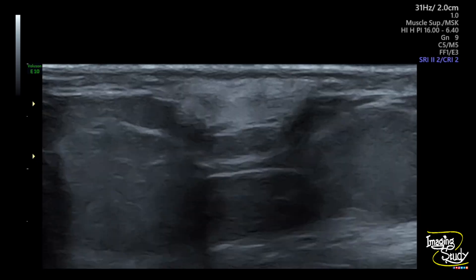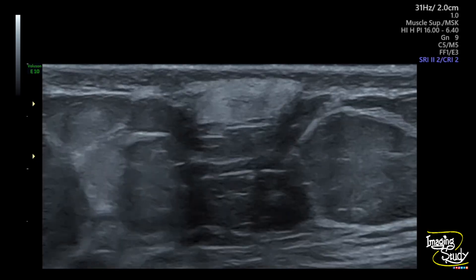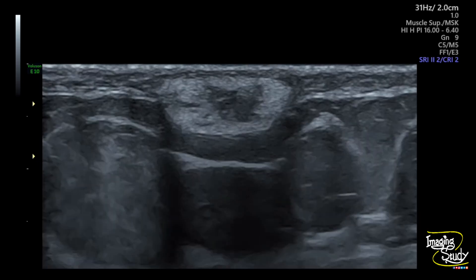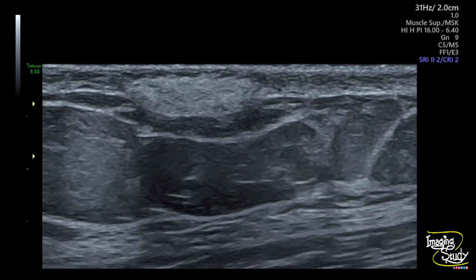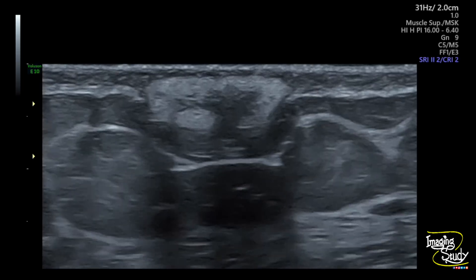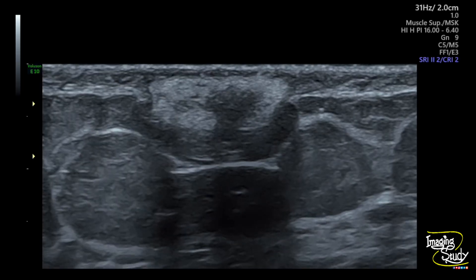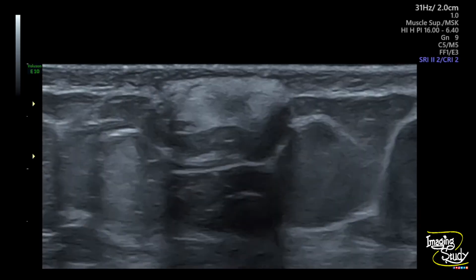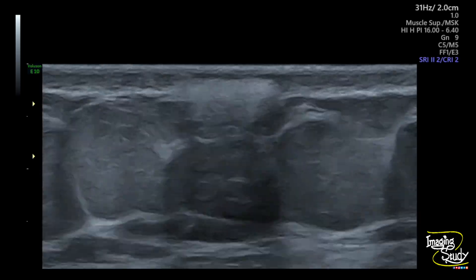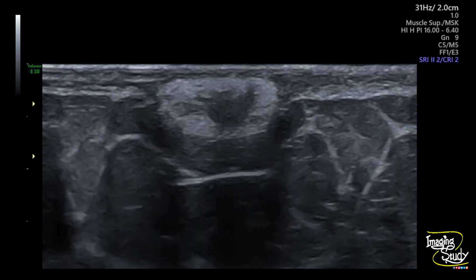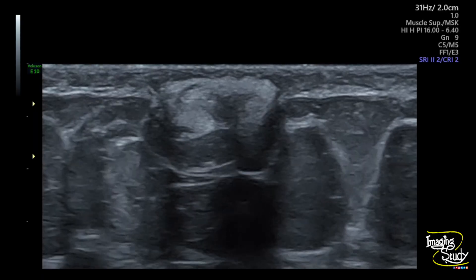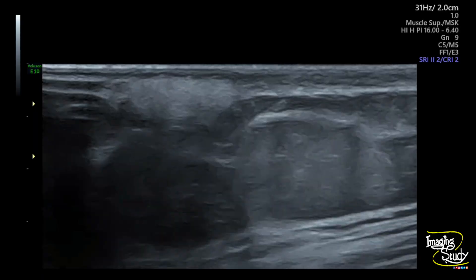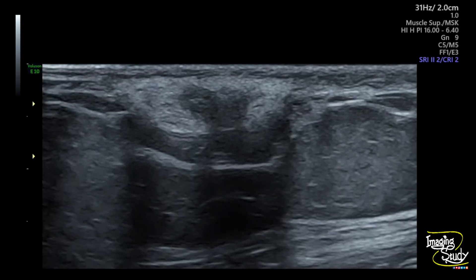So whenever you see this type of lesion with a peripheral thick hyperechoic margin and central hypoechogenicity, commonly with a history of trauma, then it's supposed to be a case of fat necrosis.